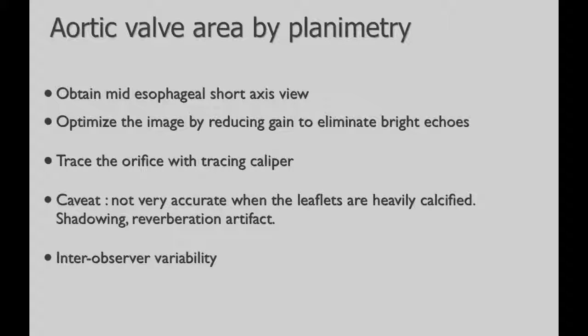other sources as well. There can also be a significant amount of inter-observer variability in terms of calculating the aortic valve area by planimetry, particularly when the valve becomes smaller.